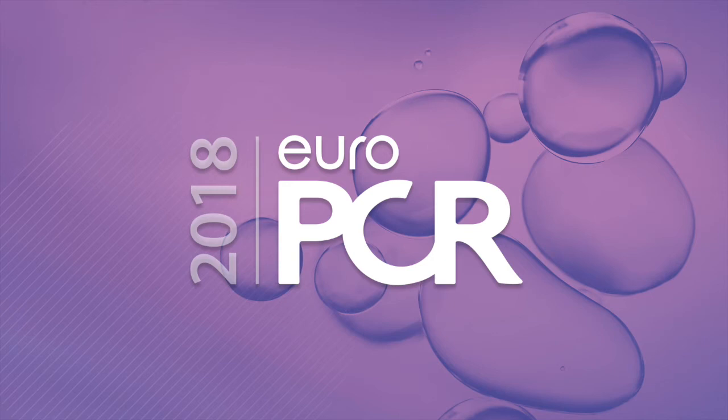One take-home point is, I know everybody wants to do radial. We are also a radial center. We started radial angioplasty in 2005 in Kuala Lumpur, Malaysia, when in America they were only doing 7 to 15% of radial angioplasty at that point in time. If you are unable to get proper support through your radial access, go to your femoral access. At the end of the day, patient safety is most important. It's not what you show on the live cases and the heroic acts that you do. It's for you to be safe.